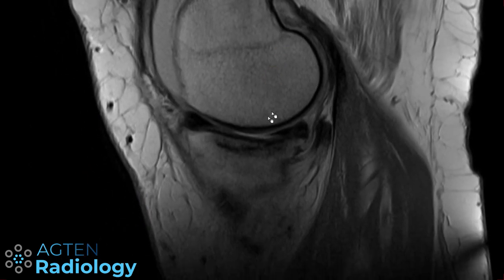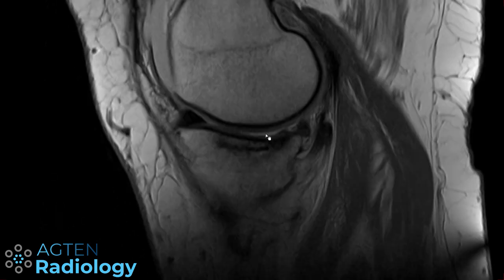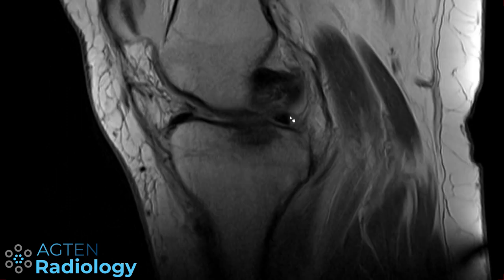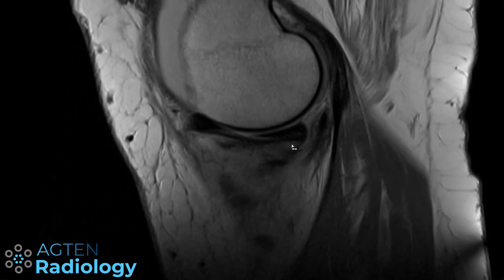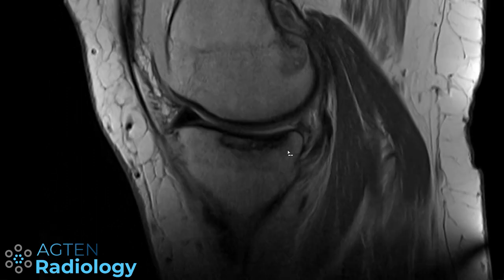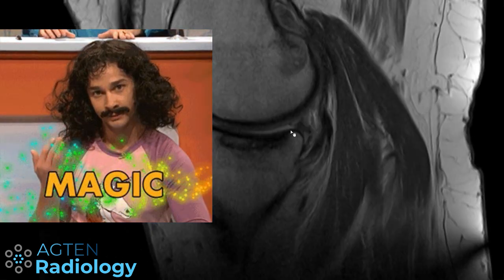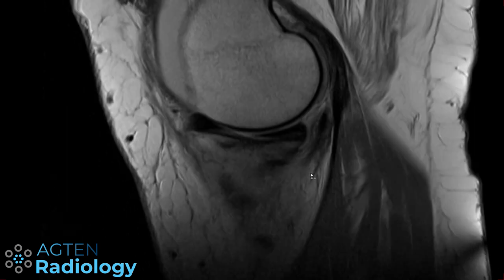If we look at this here on the sagittal view, again a proton density weighted image, the meniscus is completely gone, and then suddenly there is still meniscus left. So this is a ghost meniscus because it's disappearing, and then it's coming again. This is the root, this is the radial tear, and here the meniscus comes back again.